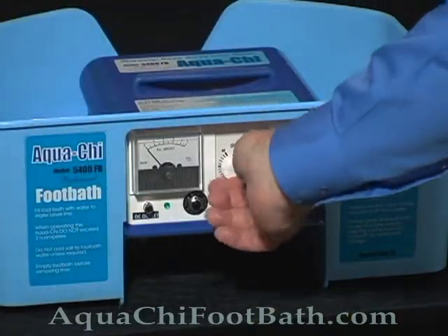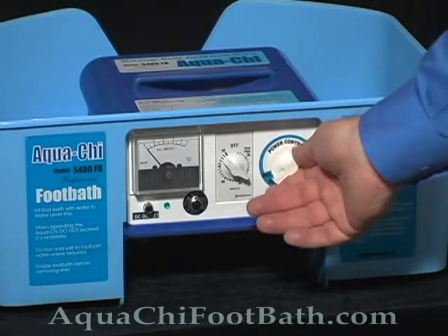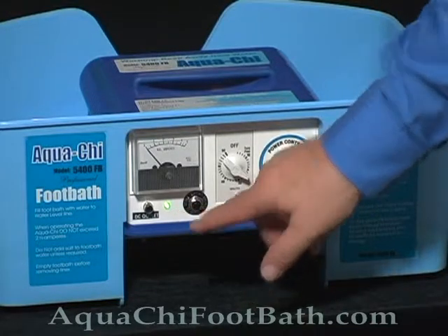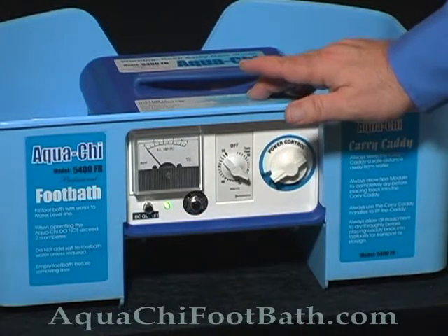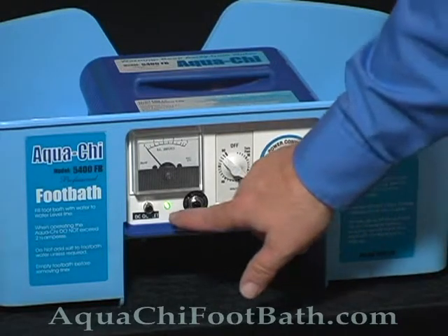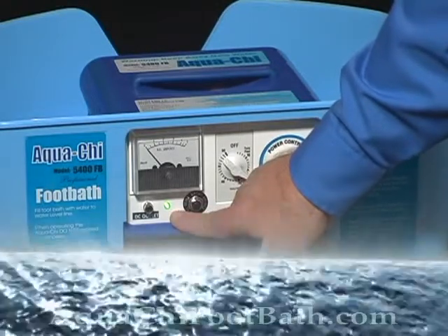And we're going to turn the timer on. And once again, turn the power control to max. And we have our green light. Now, just to check to make sure everything is fine, we're going to turn the power control back off. Now this green light is going to stay on for about 1 to 3 minutes.